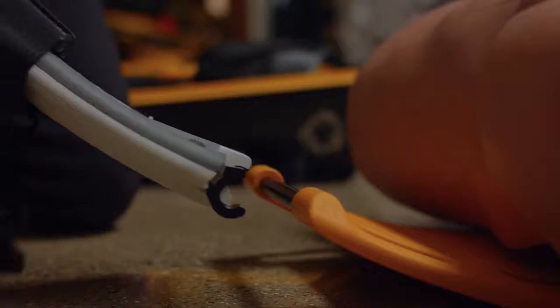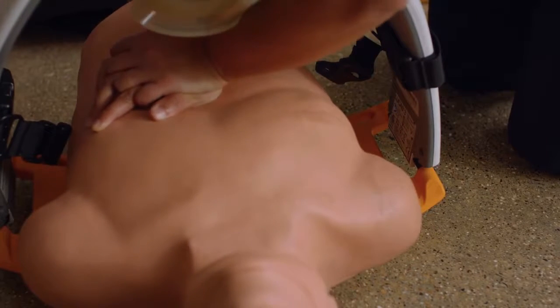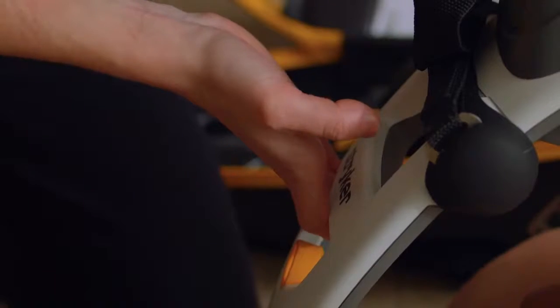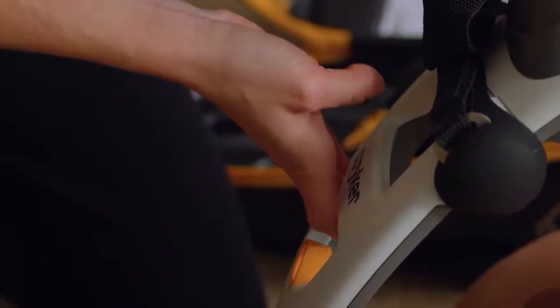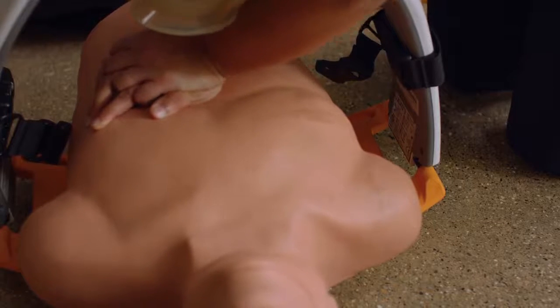As your partner continues compressions, attach the support leg nearest you to the backplate. Coordinate with your partner and swing the device quickly over the patient and listen for a click as you attach the other support leg to the opposite side. Pull up once to confirm the parts are attached on both sides. Your partner can continue manual compressions during the application.